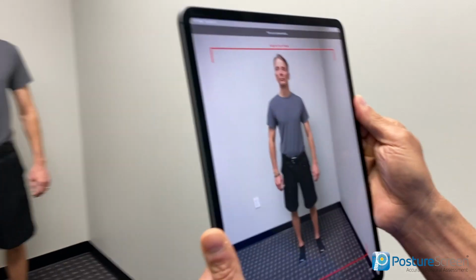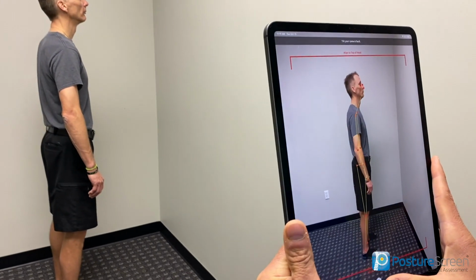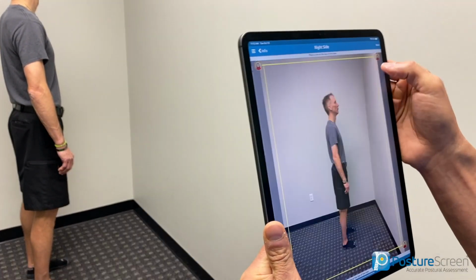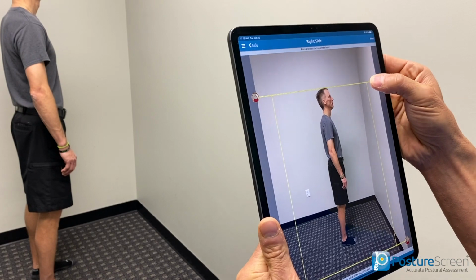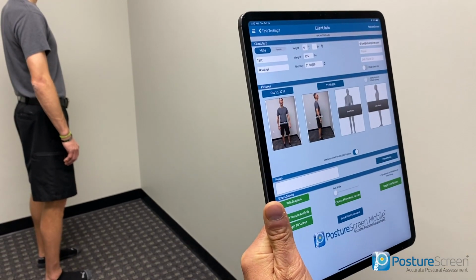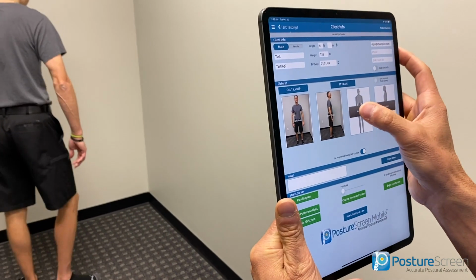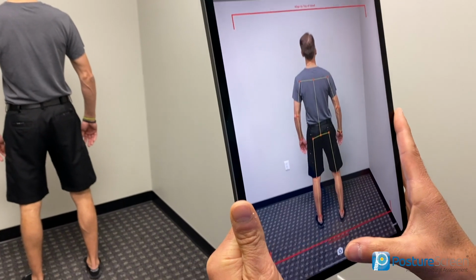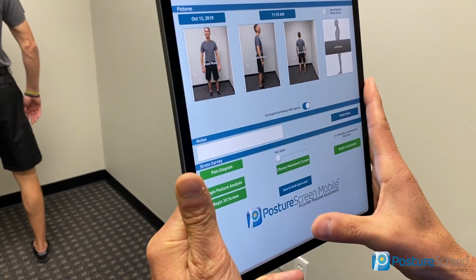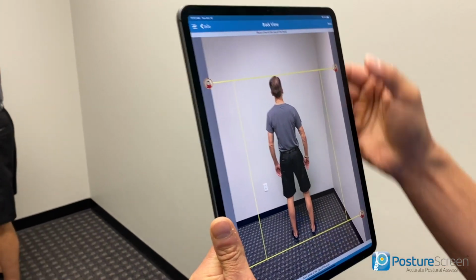Then we're gonna ask the client to turn a quarter turn. Okay, do the same thing. I'm gonna back up just a little bit here and snap the picture. Don't worry about whether the bars are turning green or red right now. We'll change the heads-up display as we go. But for right now, just get them in the brackets. Go ahead and face the wall. Okay, so look at the ankles, make sure everything is where it needs to be. We're gonna scale this, and then he's gonna do another quarter turn.